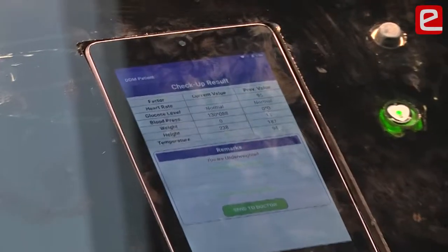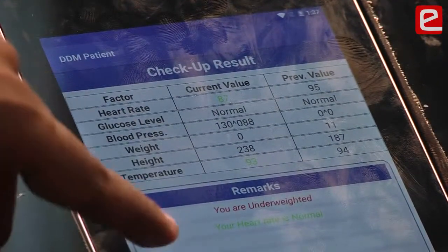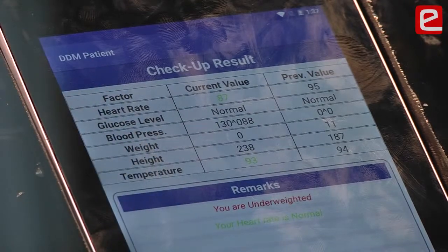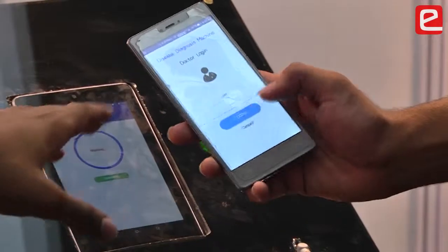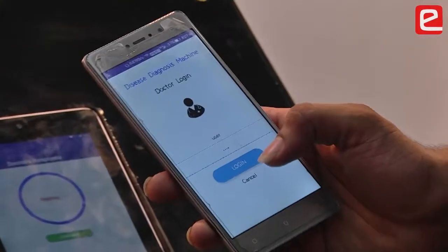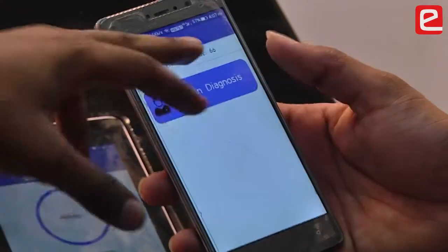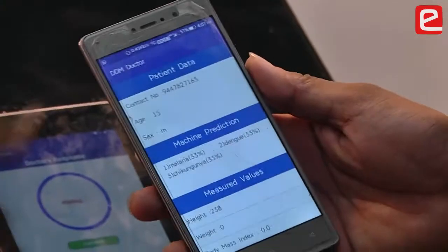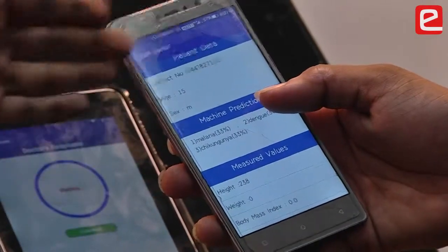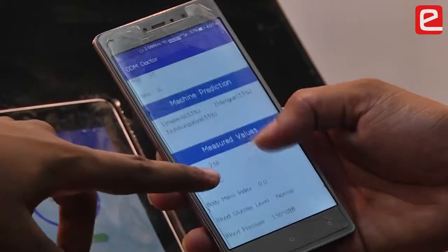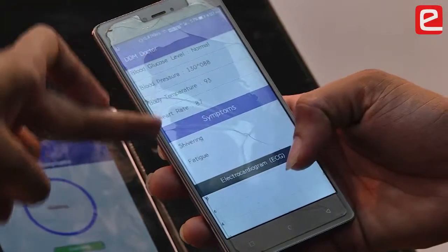These are the results of our measurements, showing the measured values and their remarks. We can then send the data to the doctor. On the doctor's app, they log in using doctor credentials and can view the number of patients in queue — currently 66 — and begin diagnosis. The doctor can view the first patient in queue, including their phone number, age, sex, and the machine's disease prediction percentage. The patient's vitals and reported symptoms are displayed here.